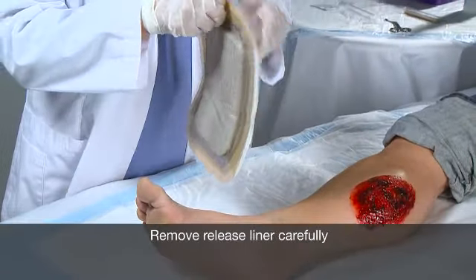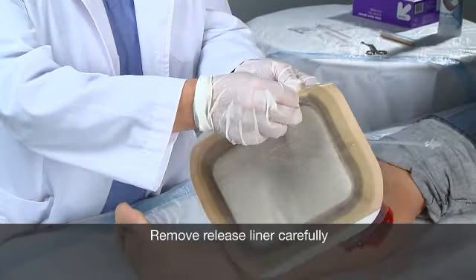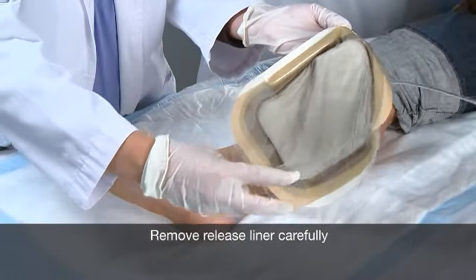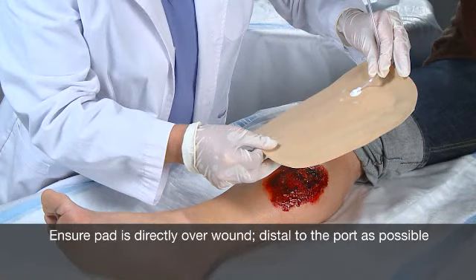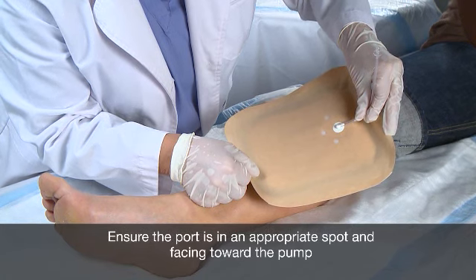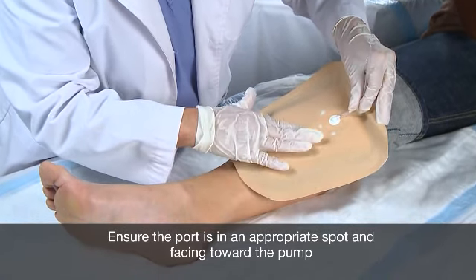The first step in applying the wound kit is to remove the release liner from the back of the wound kit, taking care not to dislodge the gasket. This will expose the adhesive side of the wound kit and the sealing gasket. Next, carefully place the wound kit over the wound, ensuring the absorbent pad is aligned with the wound and placed as distal to the port as possible, so as to obtain maximum pad absorption. You will also want to ensure the pump port is in an appropriate spot with the port facing toward the pump.